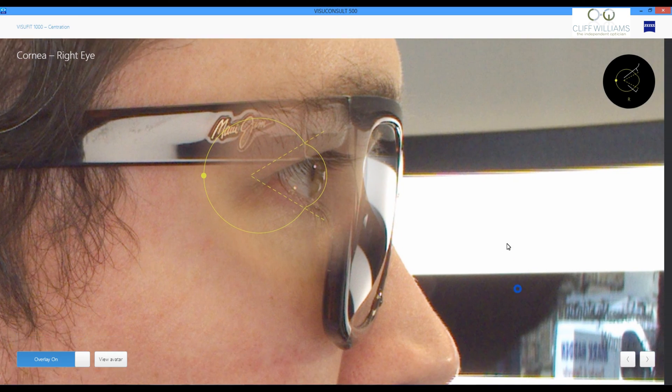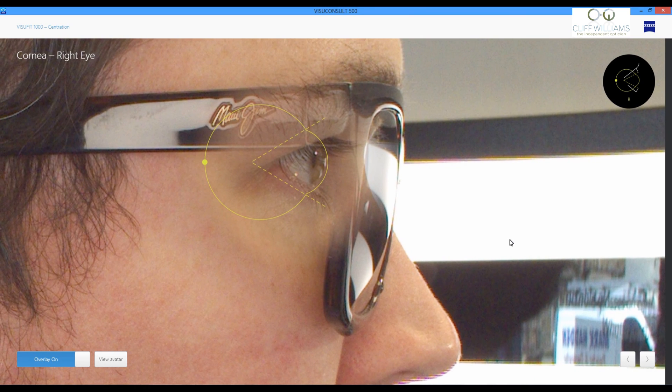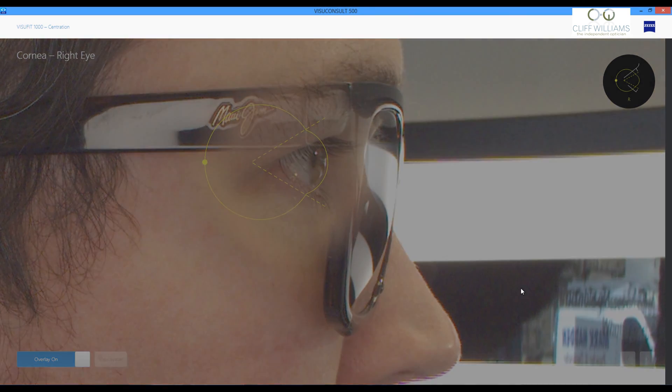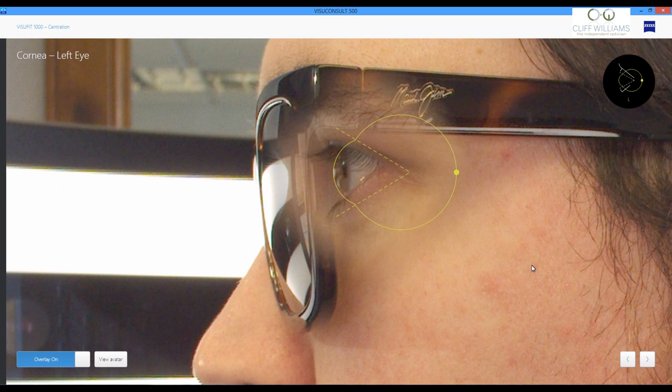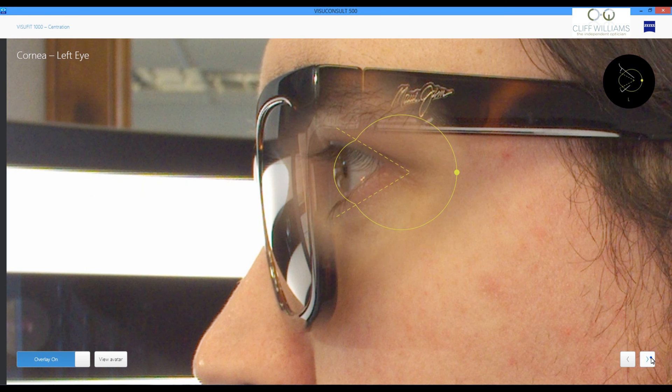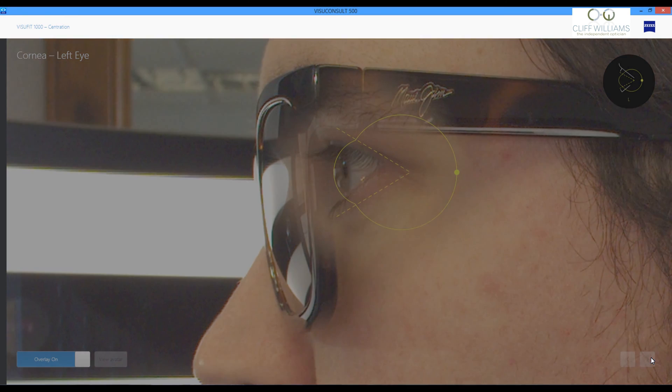We can see the cornea overlaid there. And that allows us to double check. So that's the merging of two pictures.